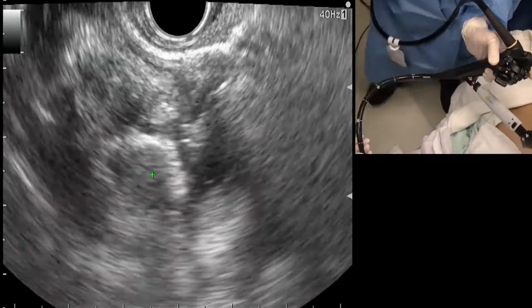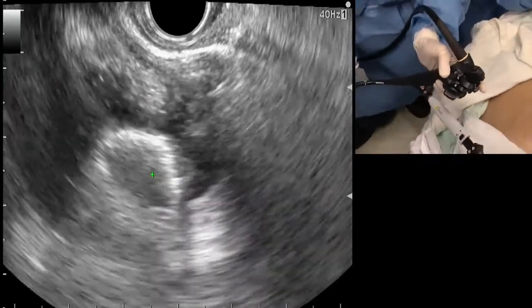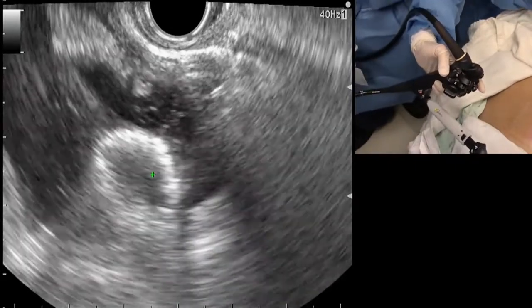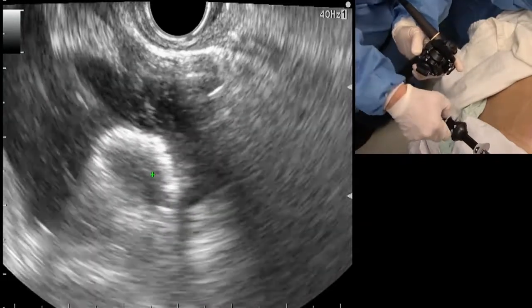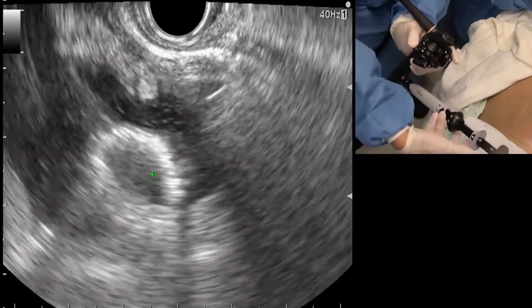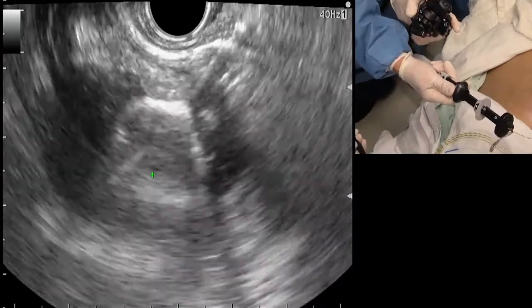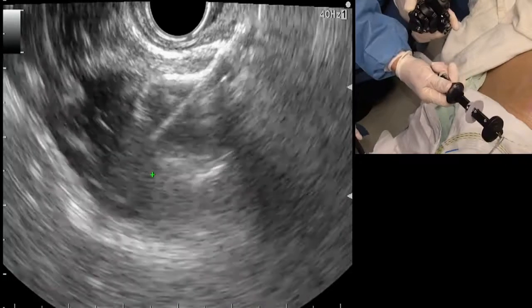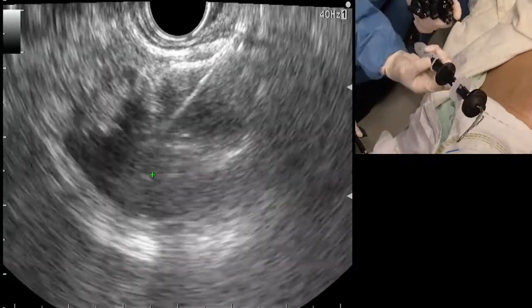Now, you see the flange. It looks like a Mars ship, right? It looks like a spaceship there that just opened up. So our spaceship now needs to land on the surface of the wall. And how do we do that? Well, now we're going to unlock our sheath, unlock. Hopefully you can see that on the screen. And I'm now going to pull back the sheath and hug it up against the wall like this. See, I'm pulling back, and wait till it deforms just a little bit. See, it deformed a little bit, it changed shape. And now I'm going to lock it again.